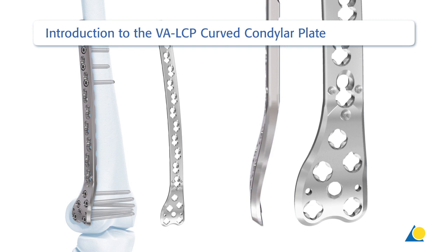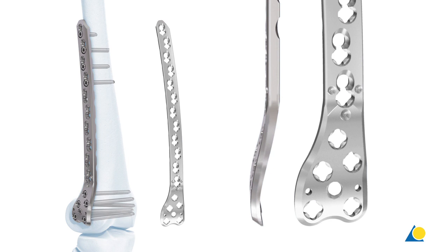The plate shaft is pre-contoured to mimic the anterior bow of the femur. The plate head is pre-contoured to match the distal femur. The plate has variable angle locking holes and variable angle combi holes.